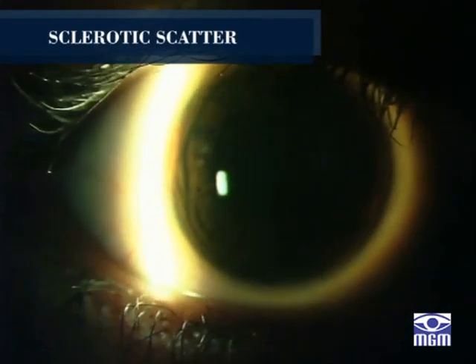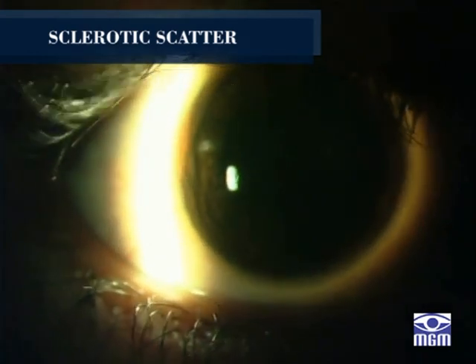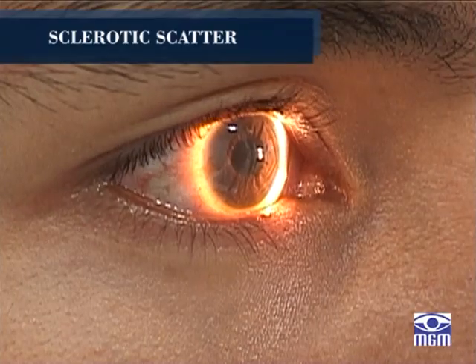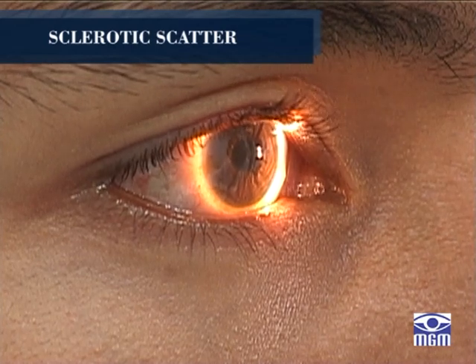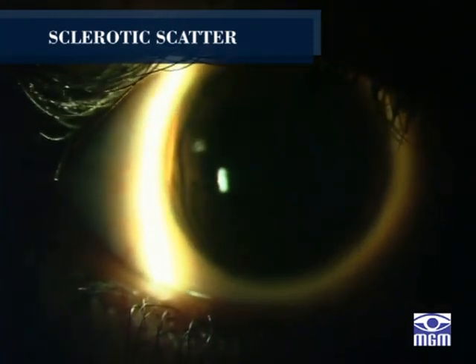Sclerotic scatter is specifically applicable to the cornea. This permits the illumination of the entire cornea against a large unilluminated background. Here, an intense beam of moderate size is directed at the corneoscleral junction. The light travels the breadth and width of the cornea by total internal reflection.